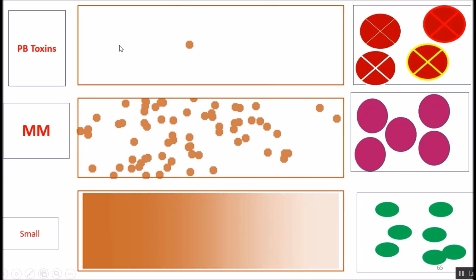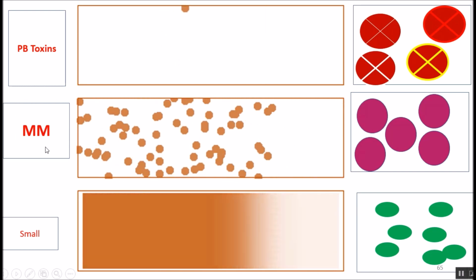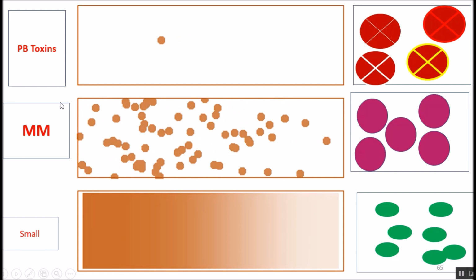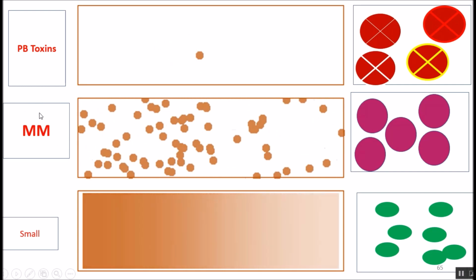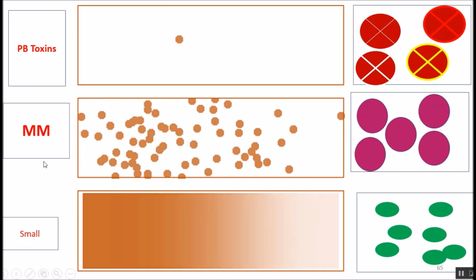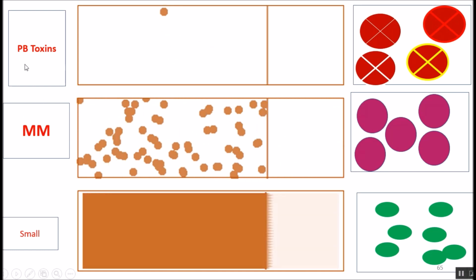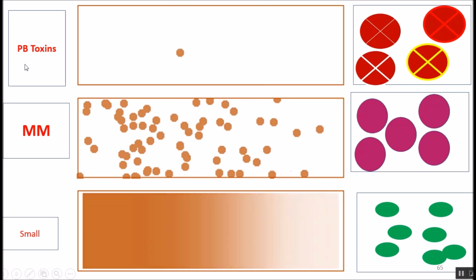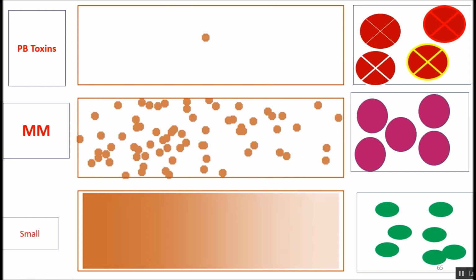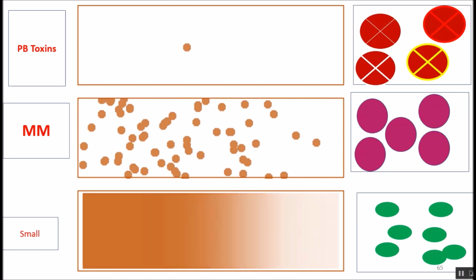Working with high flux and super flux can improve the dialysis quality because you can remove middle molecules, not only the small ones. The protein-bound toxins are hardly removed because they are carried by albumin, and the membrane is not leaky to albumin.